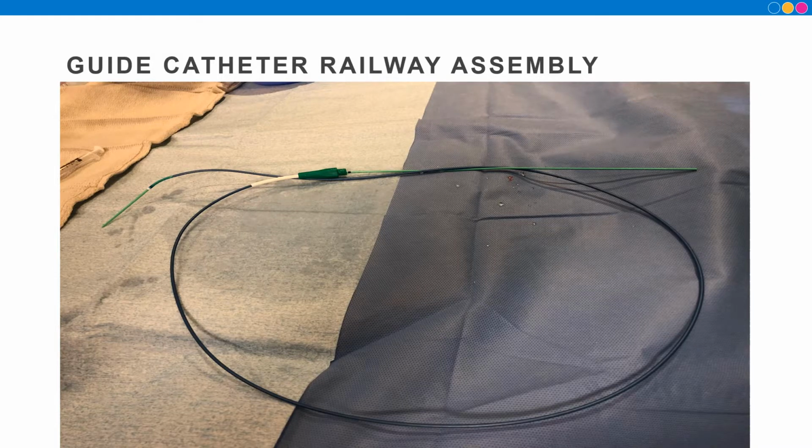How do I do that? You want to keep your assembly of the guide catheter and dilator ready. On the Railway Sheathless Access system, there are 2 dilators. There is a 0.021 inch dilator and there is a 0.035 inch dilator. Because you are converting after a diagnostic procedure for an ad hoc PCI, you want to get your 0.035 dilator inserted in a guide catheter with a backloading prepared for the PCI. So I keep my assembly prepared as seen here.